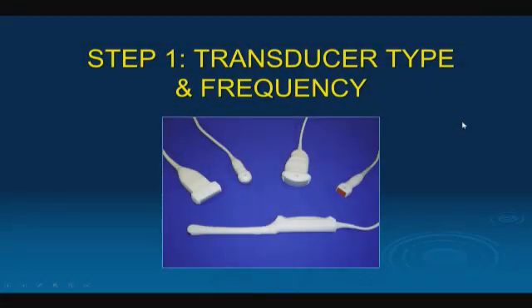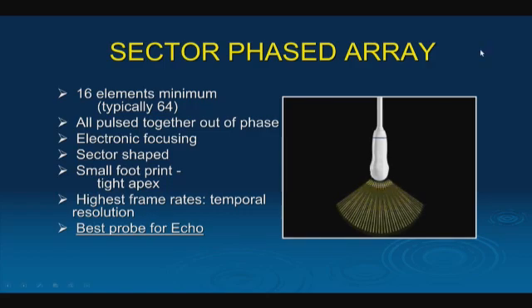All right, so the next thing is we talked about one of the factors is the transducer. So we want to make sure we're using the appropriate transducer for the type of application that we're doing. What you guys are going to be working with is a lot of different transducers, because you're involved with doing a lot of different examinations.